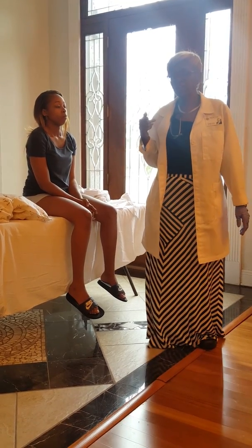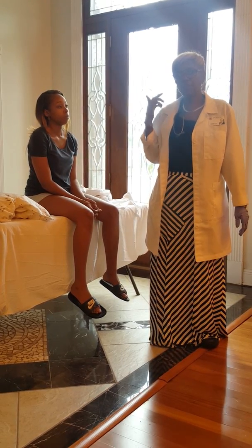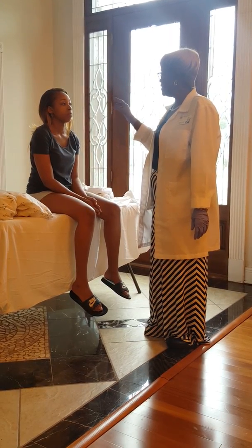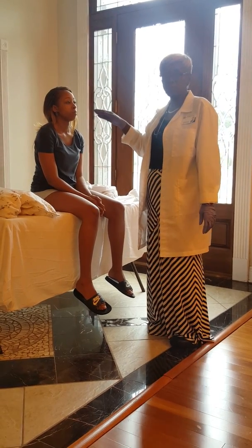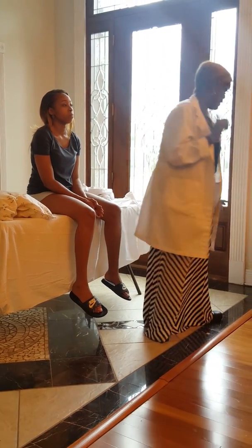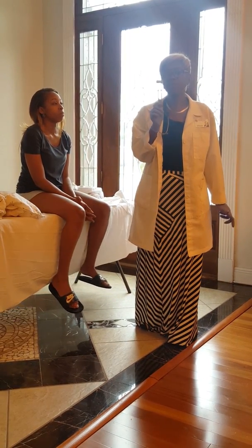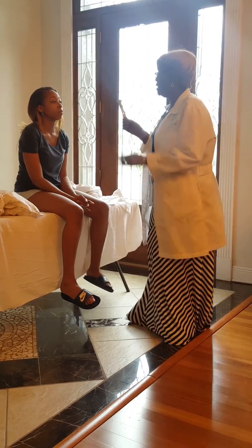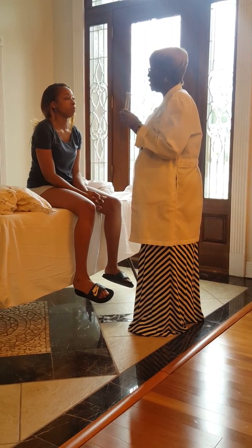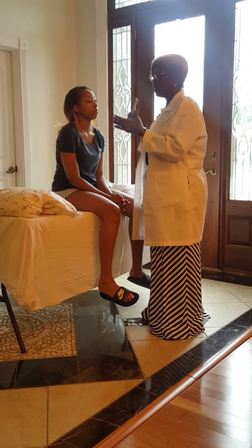The next one we're gonna check is cranial nerve number 8, which is her auditory nerve, and we're gonna check her hearing. But before we do that, I forgot to just say that her face is round, normal cephalic. I see no distortion or anything in the symmetry of her head and her face. So we're gonna check her auditory, and we're gonna use the tuning fork to test her hearing acuity. And what I'm gonna do is I'm gonna ask you to tell me when you stop hearing the tuning of the fork. So I'm gonna put your hair back.